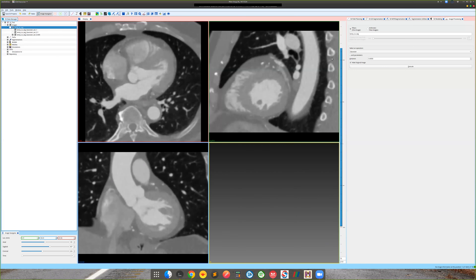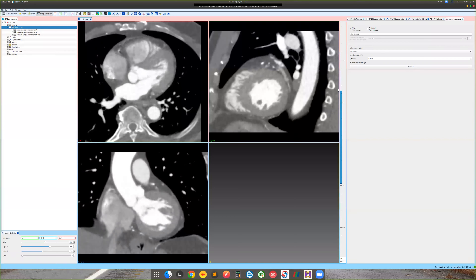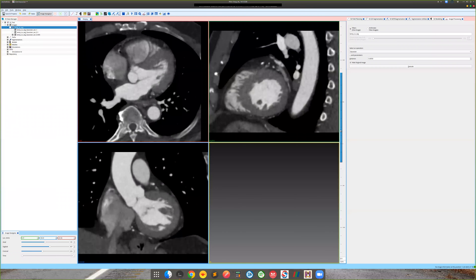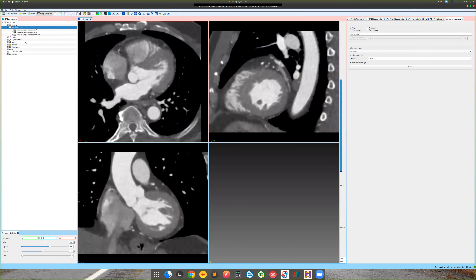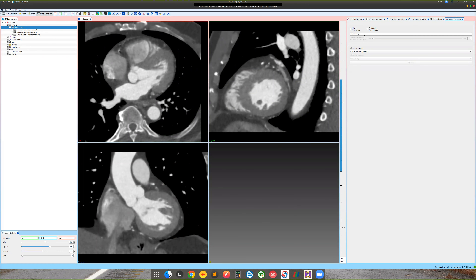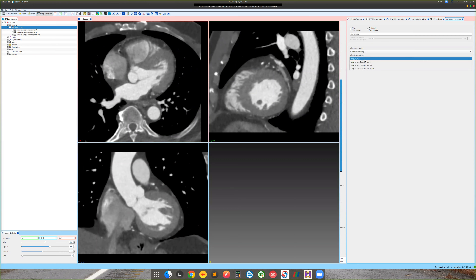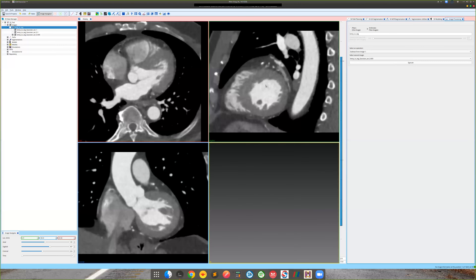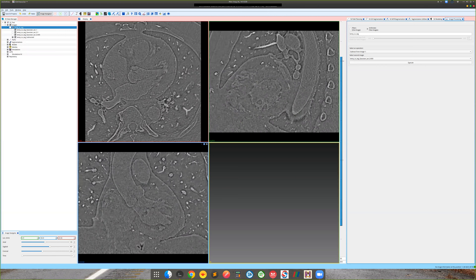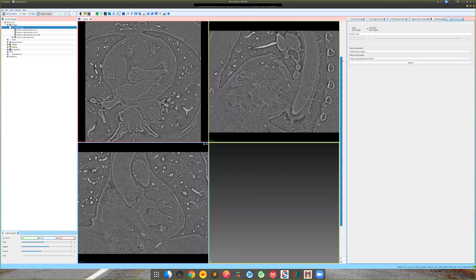This looks quite good — some of the noise in the original data has now been removed. If you want to see how much of the actual image was removed by filtration, you can do arithmetic on the two images. Select 'Arithmetic Two Images', choose the original image, and subtract the filtered image from it. What you'll notice is that all the edges have been filtered out, which also gives insight into tissue boundaries for tissue segmentation.